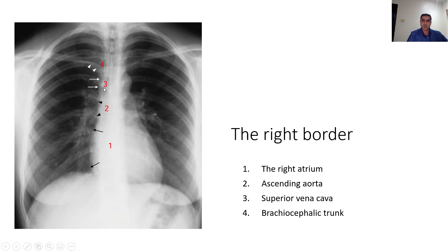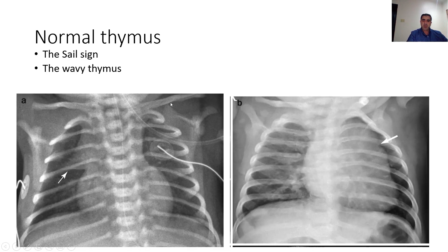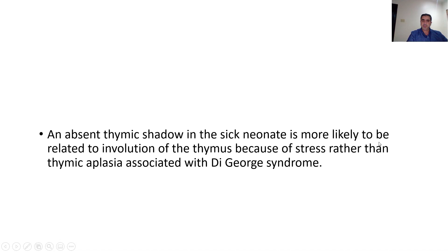The right border of the heart is composed of the right atrium, the ascending aorta, the superior vena cava, and you may also see the brachiocephalic trunk. For neonates in particular, it's important to recognize the normal appearances of the thymus — for example, the sail sign as seen here, or the wavy thymus. The absence of the thymus shadow in a neonate is more likely related to involution of the thymus due to stress rather than thymic aplasia associated with DiGeorge syndrome.